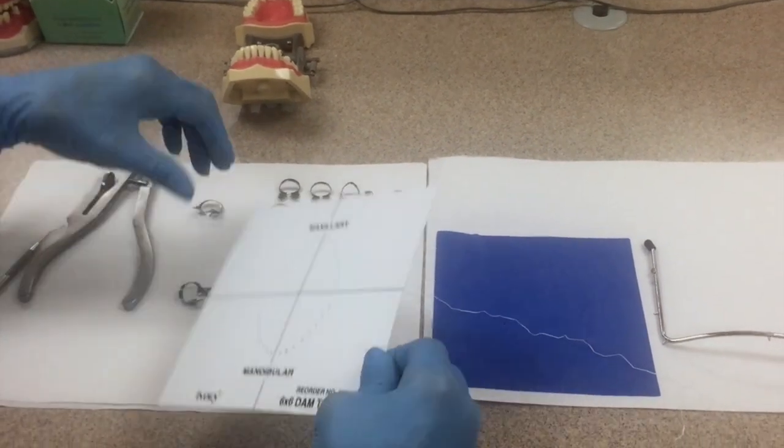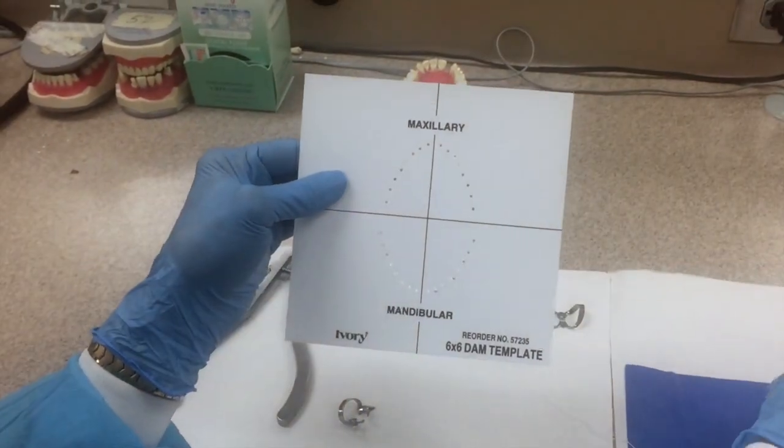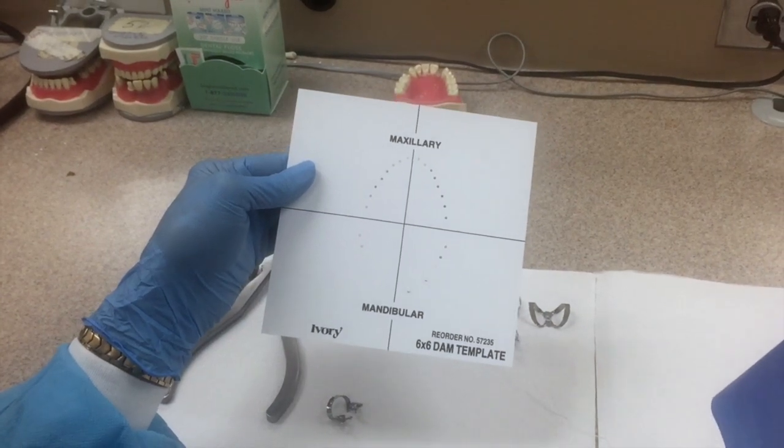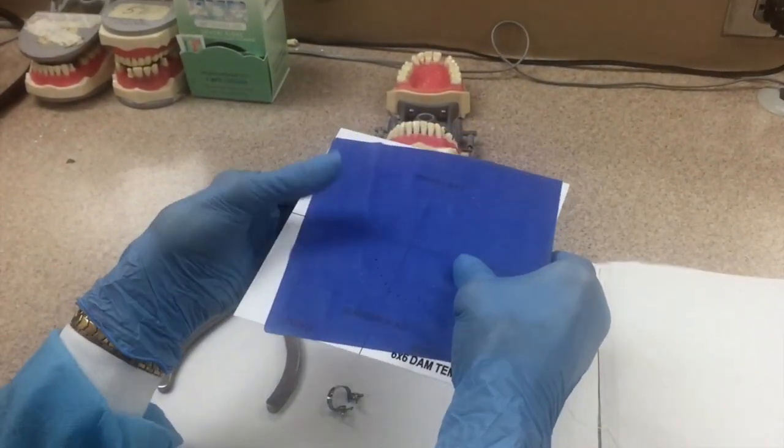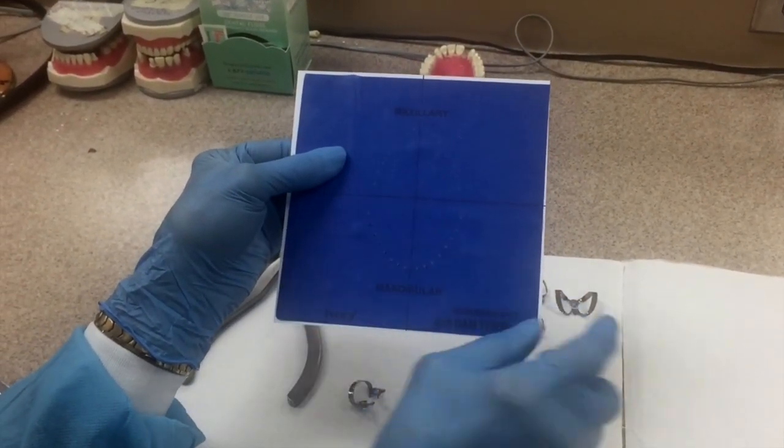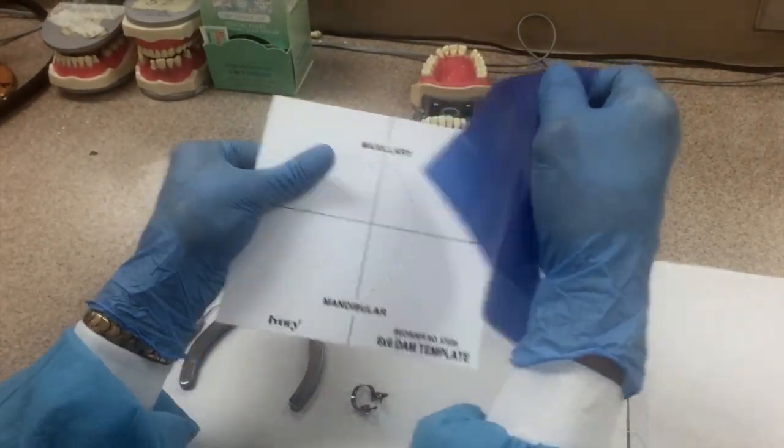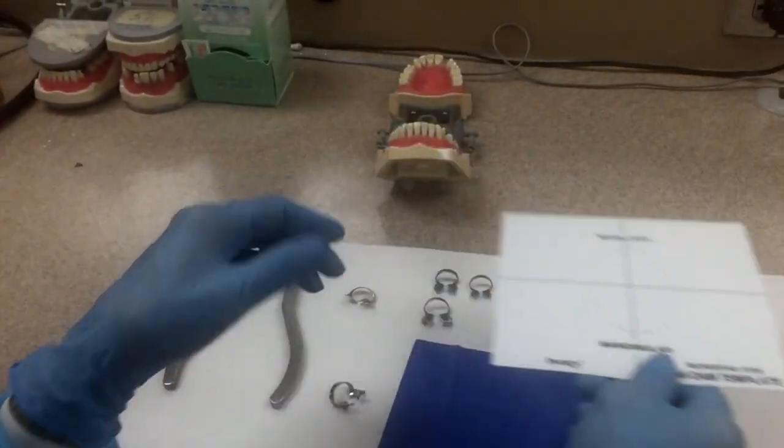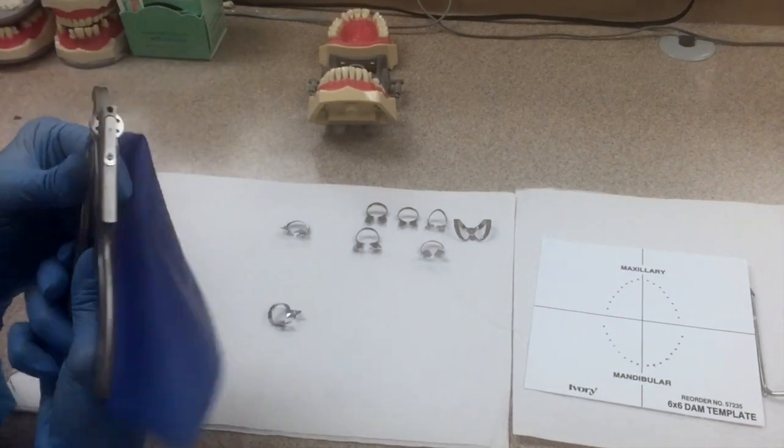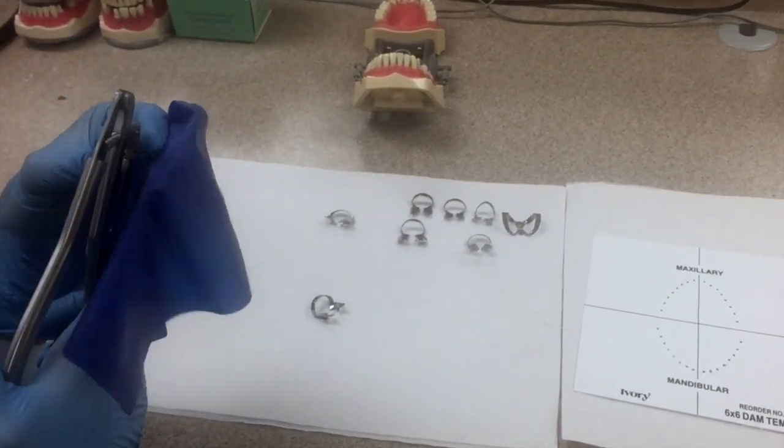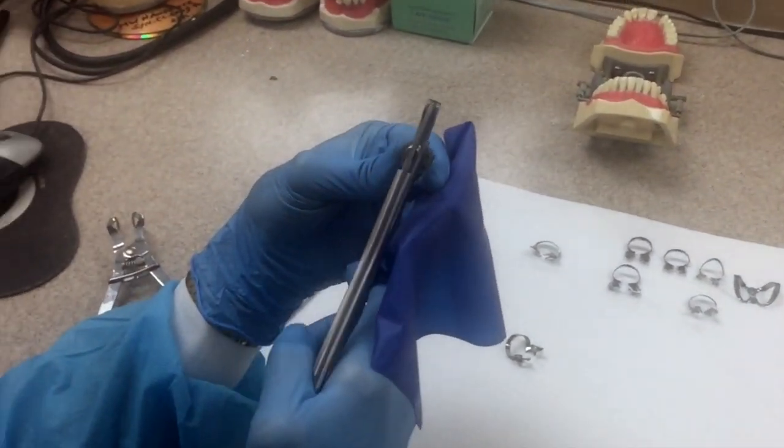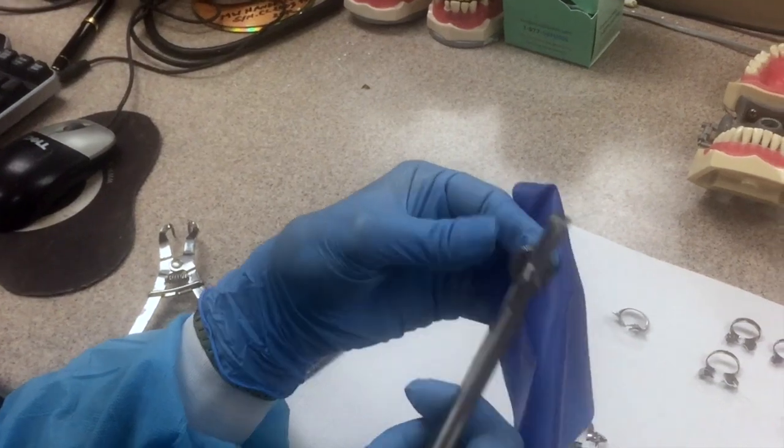This is a template. It's got little holes punched in it and we have to ascertain where we're going to put the holes in the rubber dam. We put the rubber dam over the template, take a ballpoint pen and we actually mark where we want the holes. Let's get busy and we're going to punch some holes in our rubber dam. This is a big molar, so let's use a big hole.